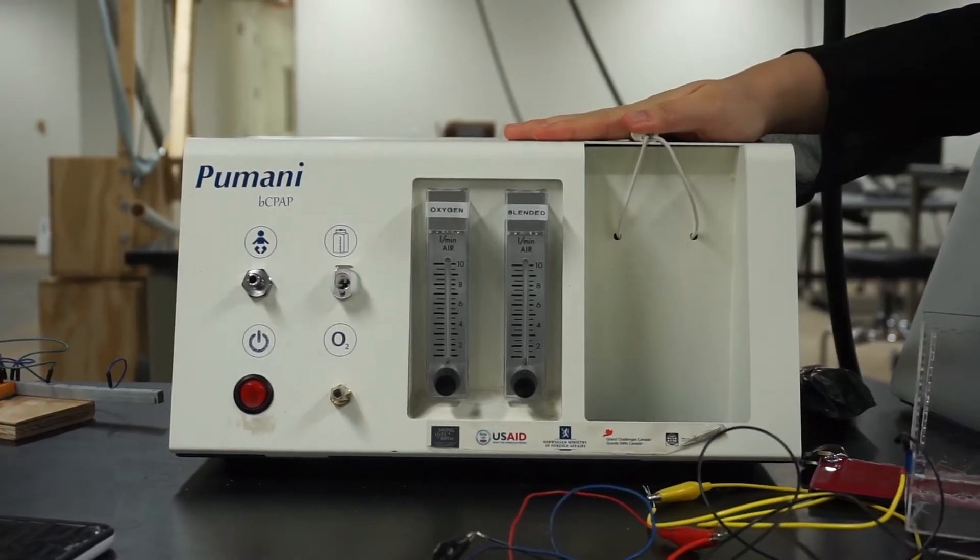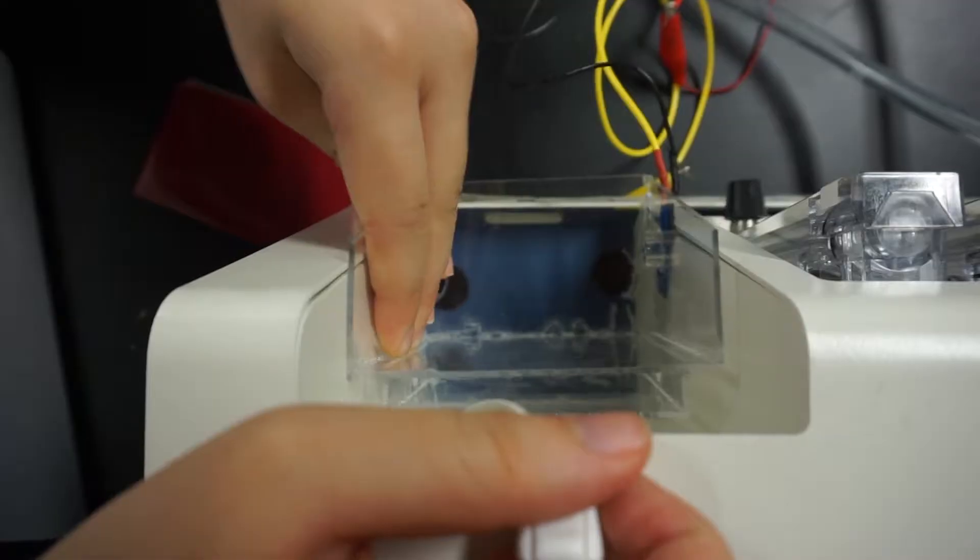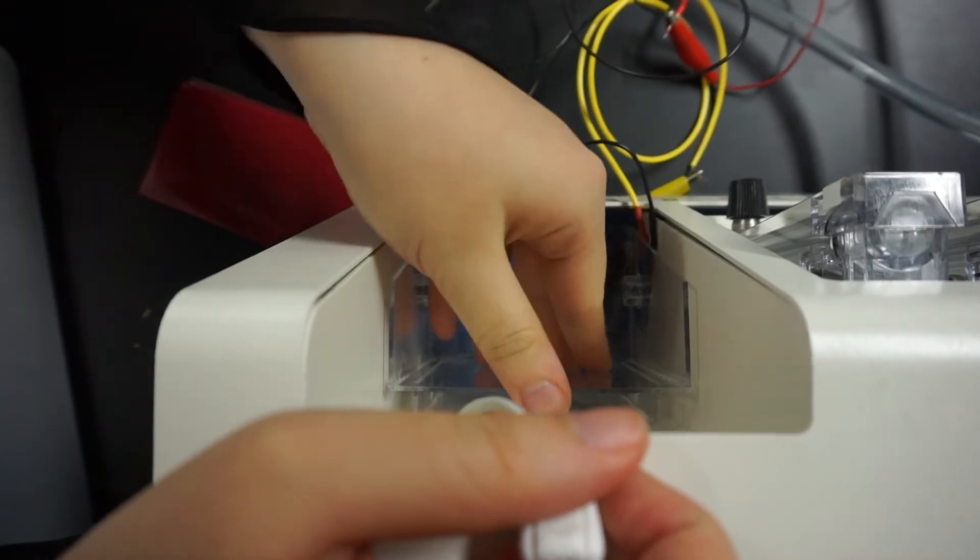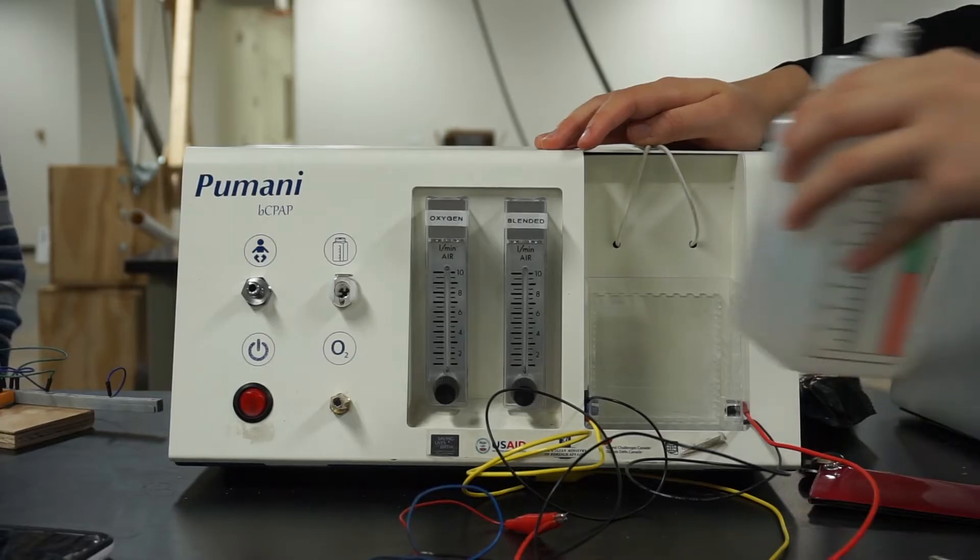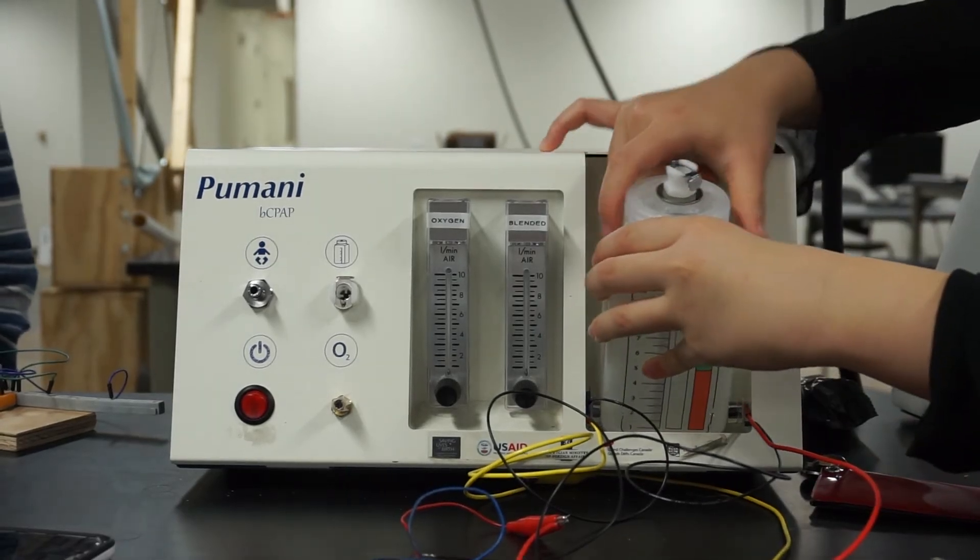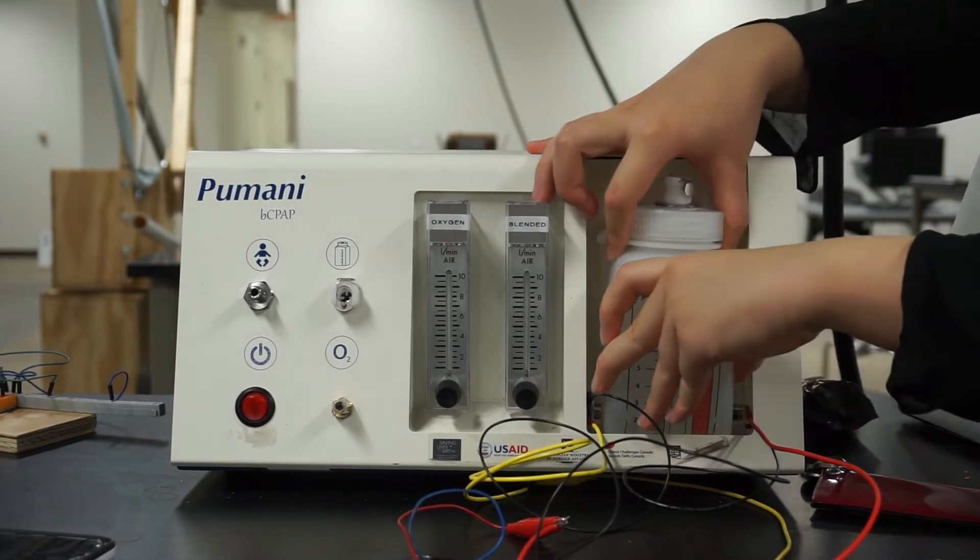The stand holds the LED and photodiode at the right height for optimal signal and fits within the cavity of the existing system, which enables our monitor to be used as an add-on in countries where the Pumani system is already utilized.